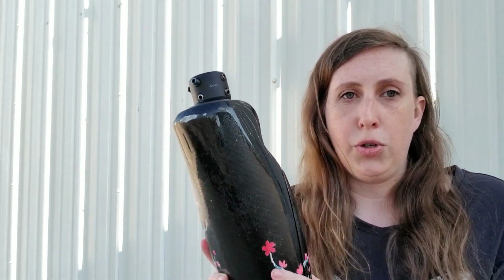It doesn't really fall off. I've had a couple times where I bump it and it falls off, but you just snap it right back on. But when I got the carbon fiber, it was just this black carbon fiber, and it looked a little too masculine. It was pretty severe looking because my socket, which is the part where my residual limb still is, was also black carbon fiber. So it was a lot of dark black carbon fiber for one side, and it just wasn't very girly. So it was just a little too masculine for me.